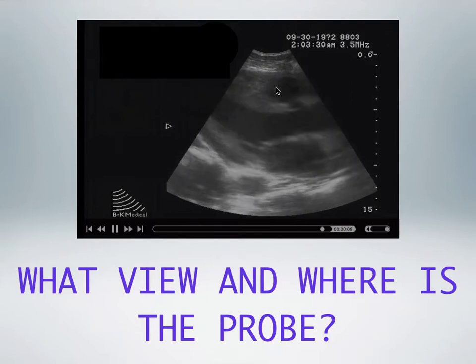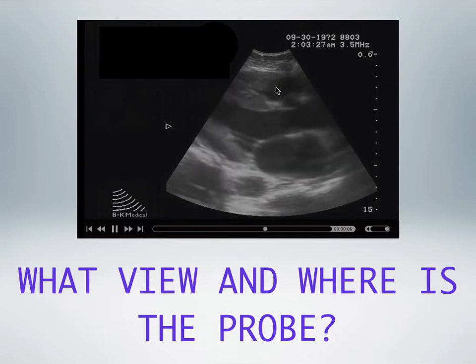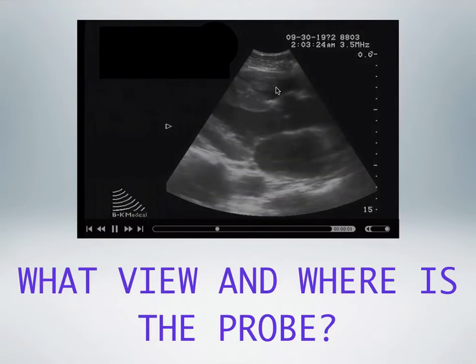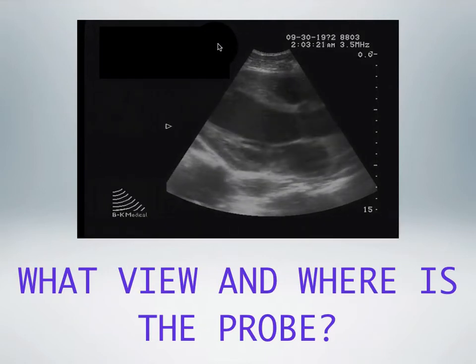And we know in trauma cases, the right ventricle is most anterior. That's the one that gets injured in blunt chest trauma, like a myocardial contusion in a car accident where the steering wheel hits the chest. In penetrating trauma, it's the right ventricle that gets injured with, for example, a knife. And where's the probe? The probe is to the left of the sternum, aiming at a 45-degree angle to the hip if you're performing this with the dot, which is not seen on this image, located where the arrow is.